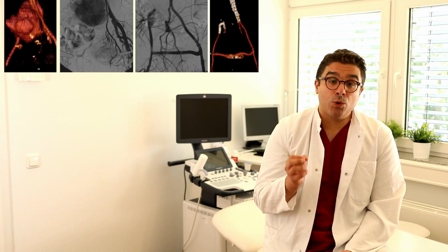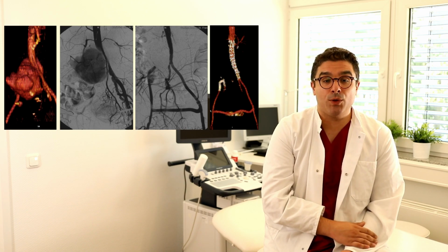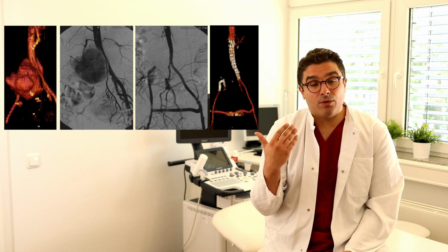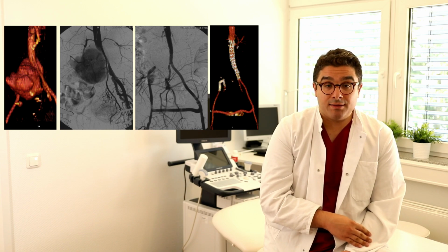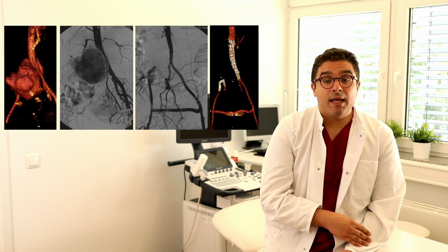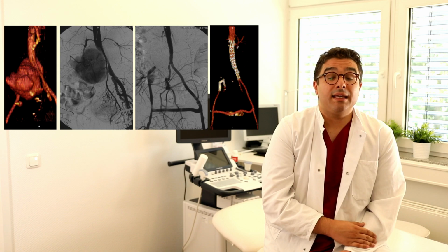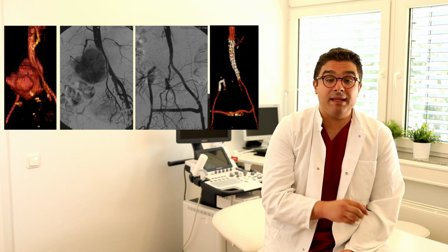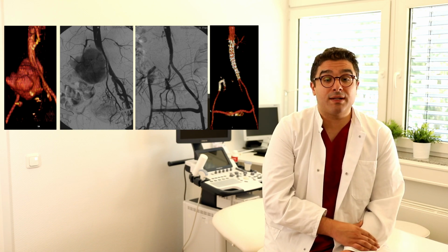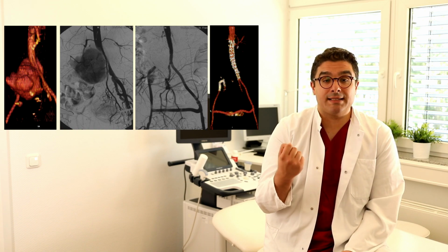Finally, the aorto uniiliac endograft is also a device that has its indication for use. These are the aortic stenosis, the already occluded iliac artery and hypogastric artery, and specific scenarios of emergencies where you cannot gain access from both iliac arteries. In such case, you have to perform a crossover bypass, and you can maintain the perfusion of the hypogastric artery if this is necessary with the so-called banana technique.